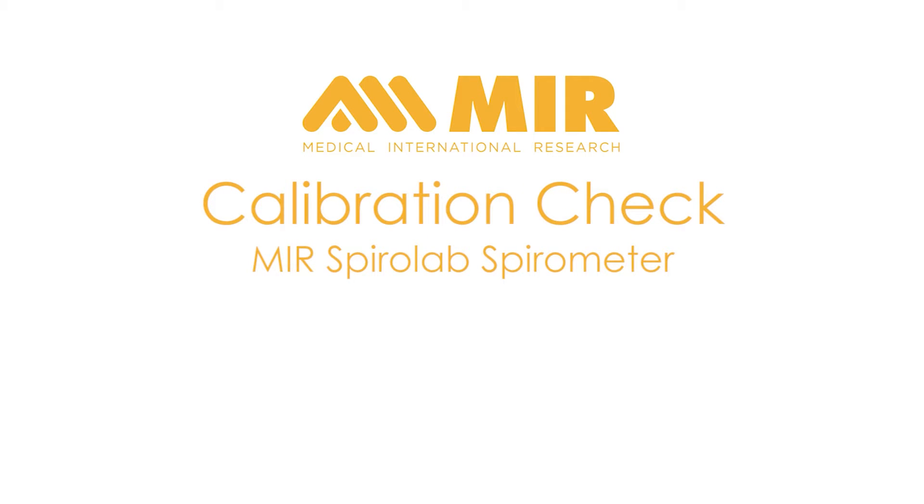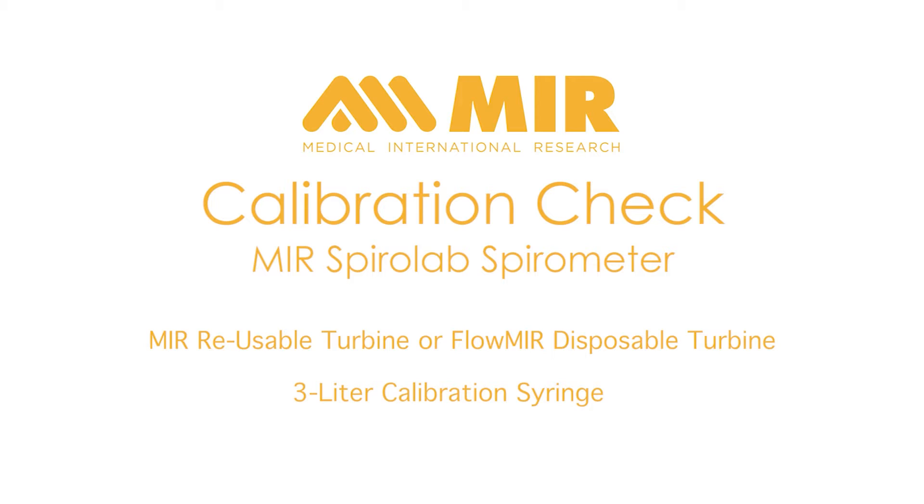This video is designed to show you how to do a calibration check with an MIR SpiroLab spirometer and either the MIR reusable turbine or the Flomir disposable turbine and a 3-liter syringe. For this video, we will be showing the MIR reusable turbine. Because the Flomir disposable turbine is pre-calibrated when it is manufactured, it may not be necessary to do a calibration check unless required by your facility or organization. The calibration check procedure is exactly the same if you are using the Flomir disposable turbine.